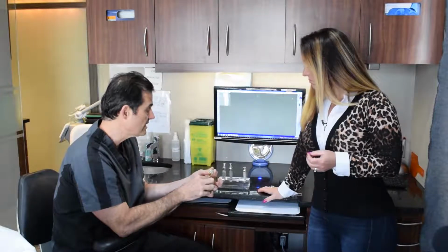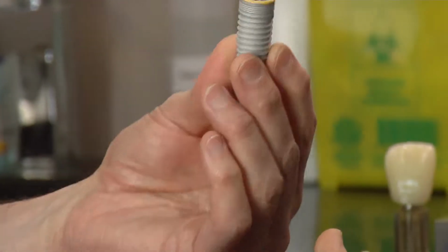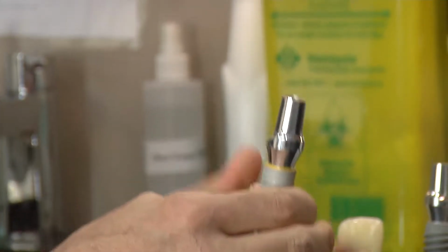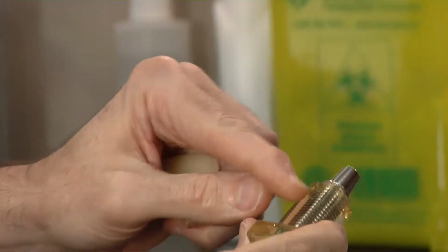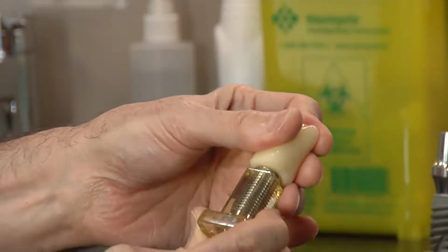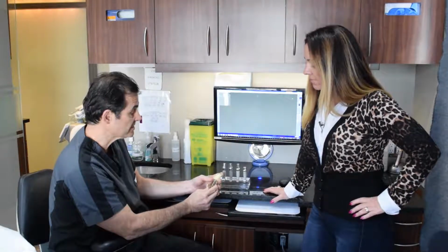So basically what we generally will do, say you're missing a tooth or you're about to lose one, then we can put one implant in, we put a post on top of it, and then we put a crown on top of that. This little model shows you that in more detail. We've got the implant in this acrylic jawbone, the post is attached on top, and then the crown goes over top of that. That's in effect how we might replace one missing tooth. So that's an implant in a nutshell.